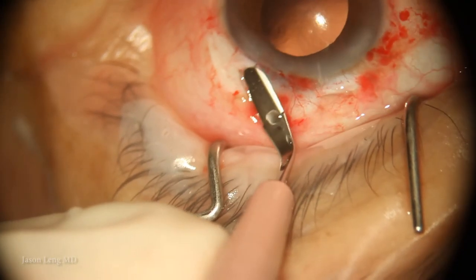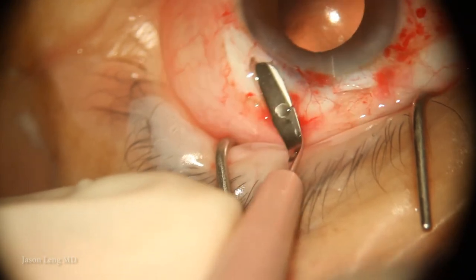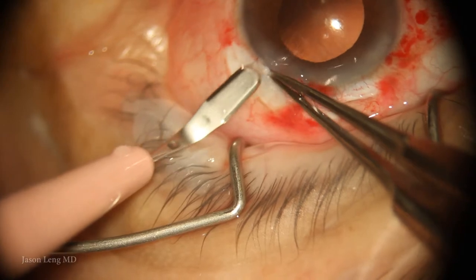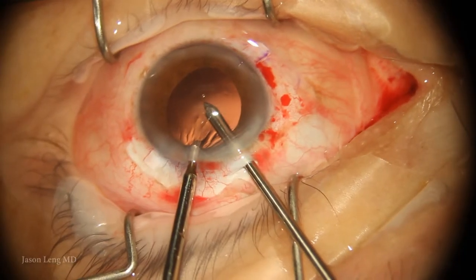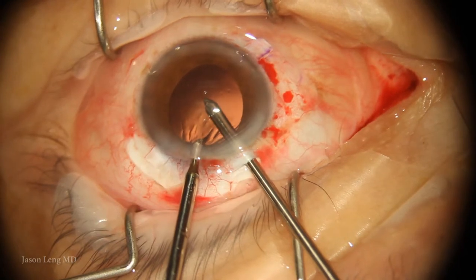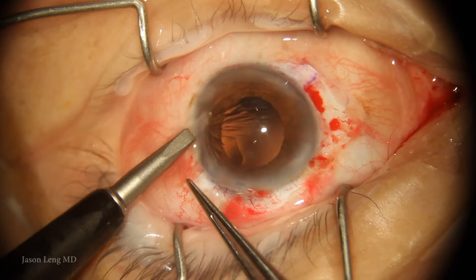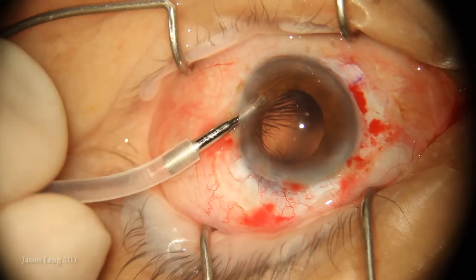On this side the flap is embarrassingly thin — I generally prefer a bit thicker, but I was paranoid given my experience with his other eye. Here I'm doing a little bit of anterior vitrectomy to make more space for inserting the IOL. And I'm making another paracentesis in a slightly tangential approach for my AC maintainer.